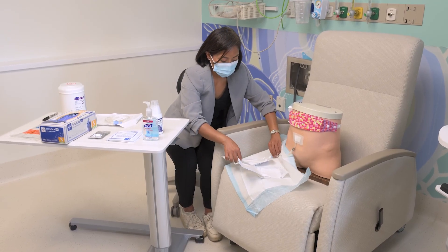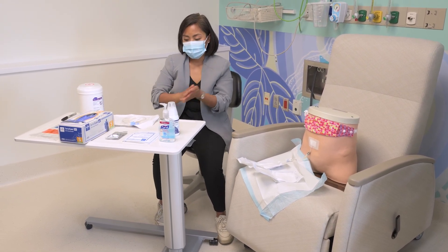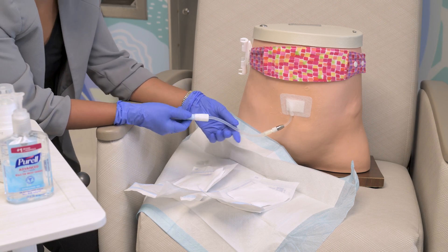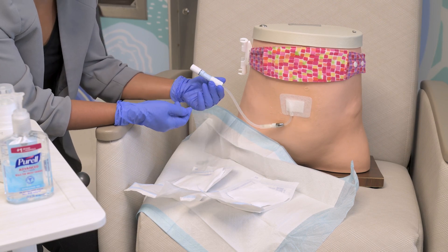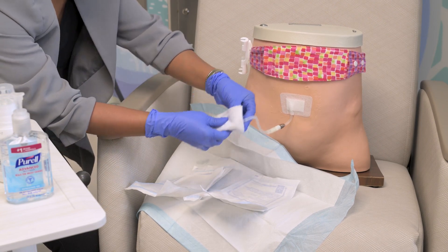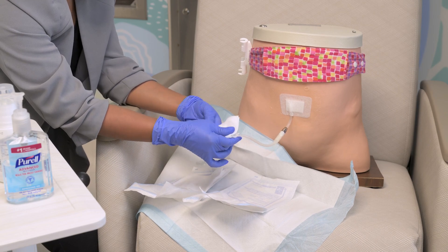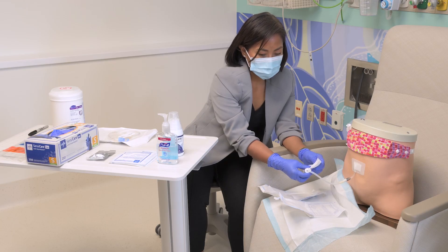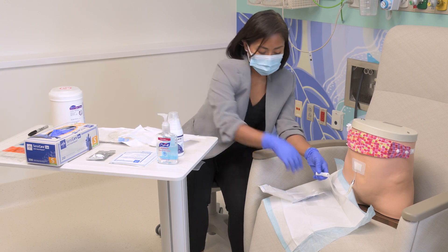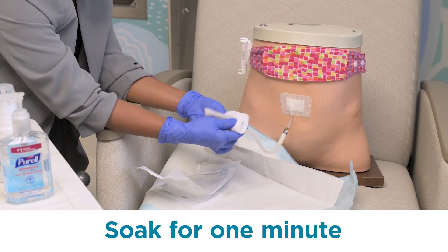Next, gel your hands then put on your proper size gloves. The transfer set is attached to the PD catheter. Scrub the end of the transfer set with the first gauze saturated with Alcavist for one minute. Then wrap the end of the transfer set with a new 4x4 saturated with Alcavist and let it soak for one minute.